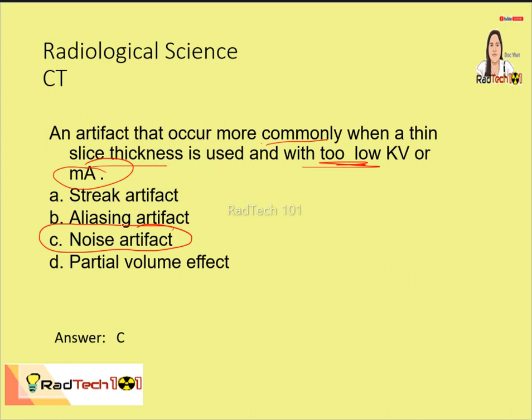Dapat kapag gusto nating iwasan na magkaroon ng noise artifact, so dagdagan, di ba? Thicker or increase slice thickness, katulad ng na-discuss natin sa previous questions kanina.